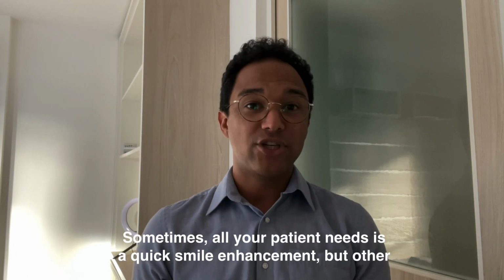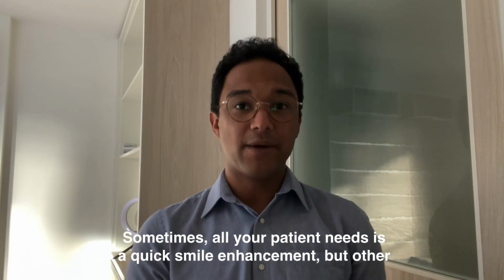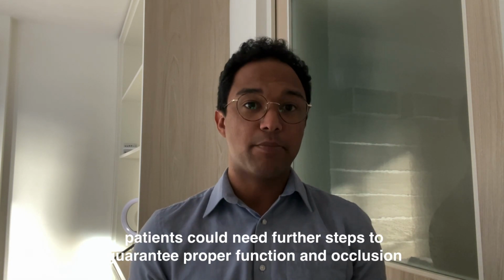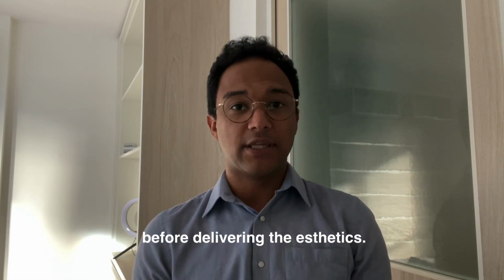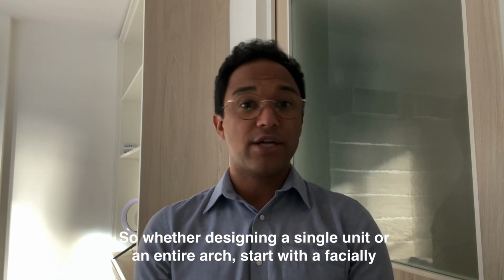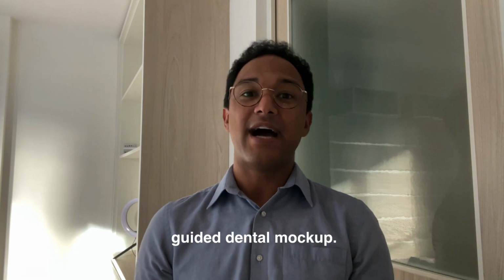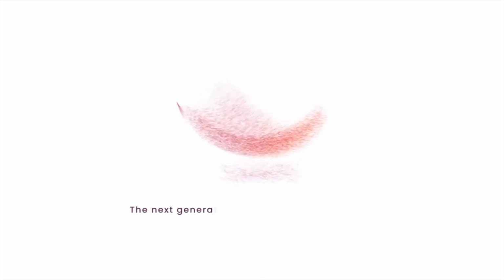Sometimes all your patient needs is a quick smile enhancement, but other patients could need further steps to guarantee proper function and occlusion before delivering the aesthetics. So whether designing a single unit or an entire arch, start with a facially guided dental mock-up. Start with SmileFy.